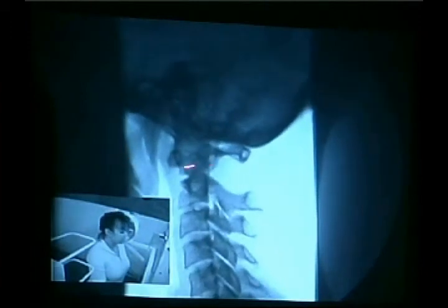Oh, here's another transverse ligament. Look at this. Everybody thought she was faking it. Watch her C1. It's going to shift. It'll shift back again, but you'll see her lose her balance here outside and in. So she's like going, whoa. The doctor goes, I can't believe it. Her head's not attached. That's a torn transverse ligament. These are significant, serious injuries. Let me speed through these.